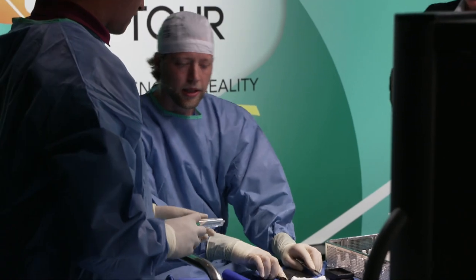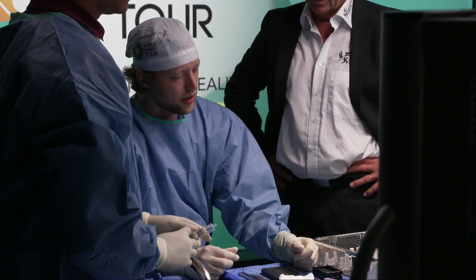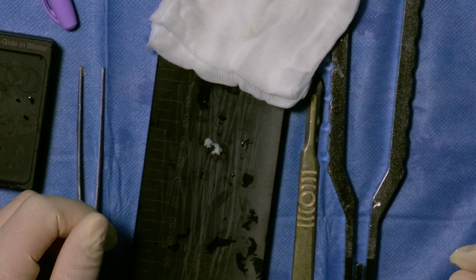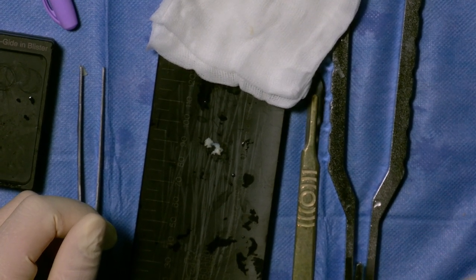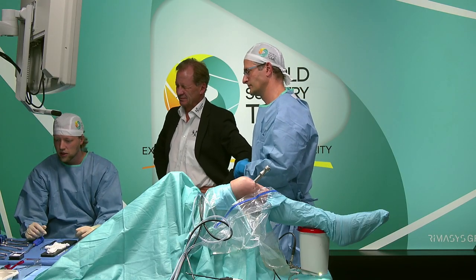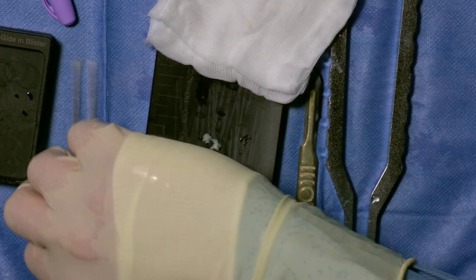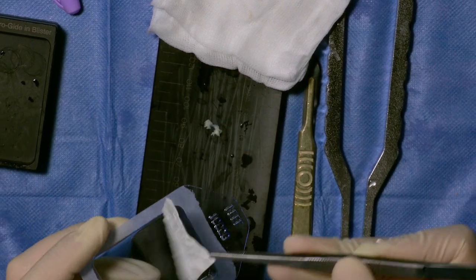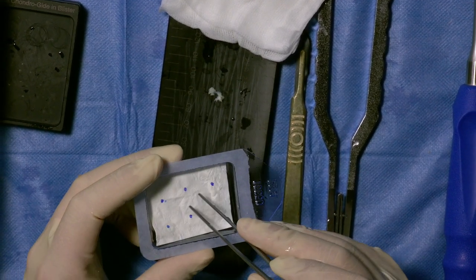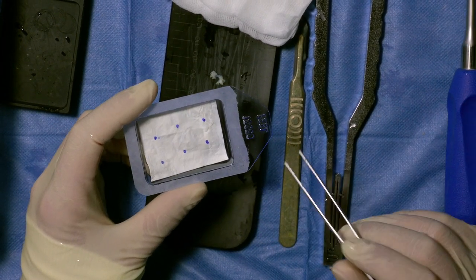So that looks nice. How small should it be? As small as possible, but... Size of a cell. Yeah, if you can do that. But I like to use a knife for doing it, because if you use something to punch on it, maybe the cells get destroyed, and I want to prevent that, so I just use a knife to cut it. Then it's always extremely important, this membrane, if we take a look at it here with our anatomic forceps, has two sides, right? So one rough side, and then the top of the membrane. And the membrane needs to be cut wet, you should first put some water on it to make it wet, and then it's easy to cut.